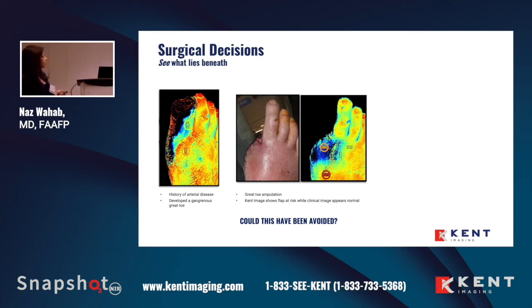So you can see here, we had a patient prior to amputation imaging, and you can see that it's a little bit difficult, but there it shows about 40% oxygenation there and about 64 here. So nonetheless, the amputation was performed. To the naked eye, those of us who've been practicing a long time, I think we take for granted that we have a certain clinical acumen that we know and we can predict. But I think most of us could probably agree that this didn't look terrible, and you probably couldn't demarcate exactly where the issue is really happening.